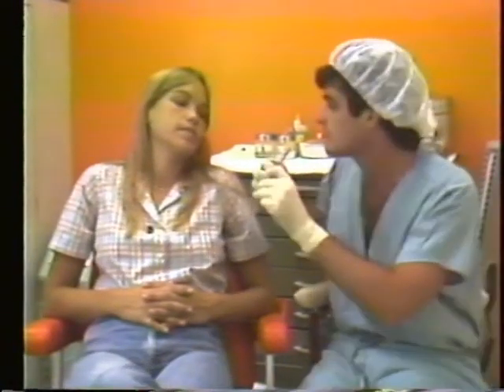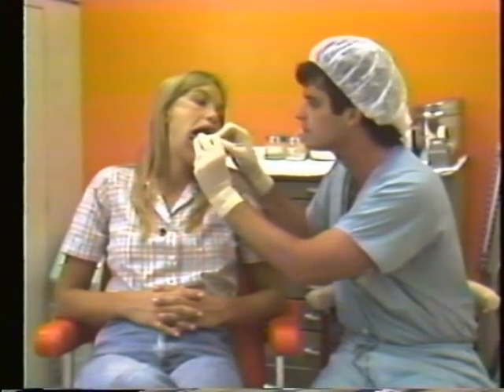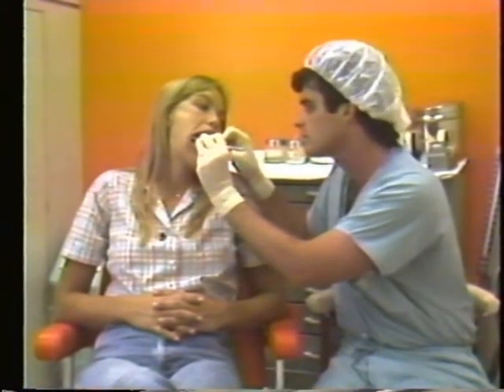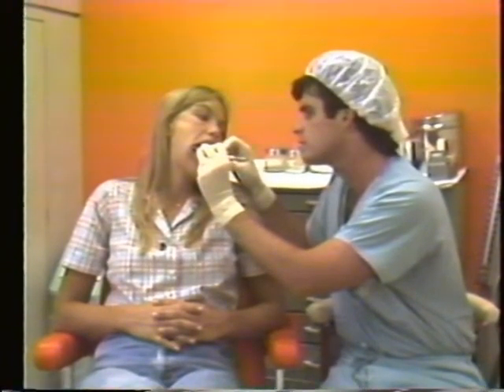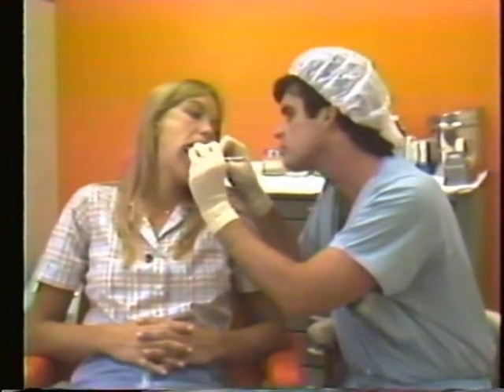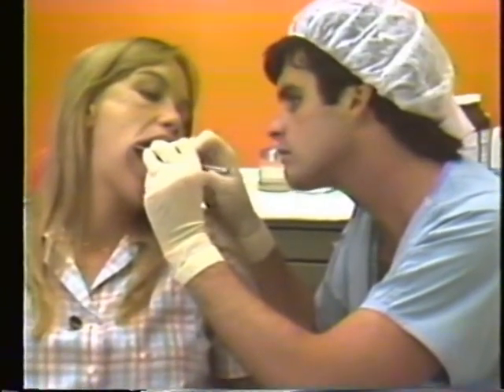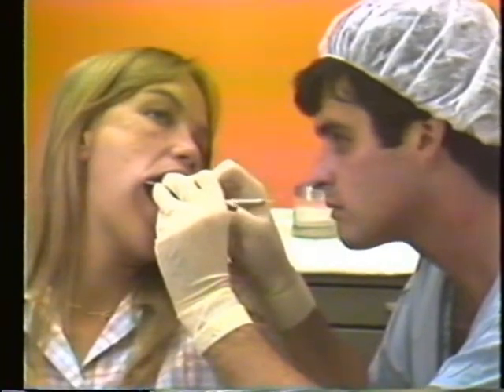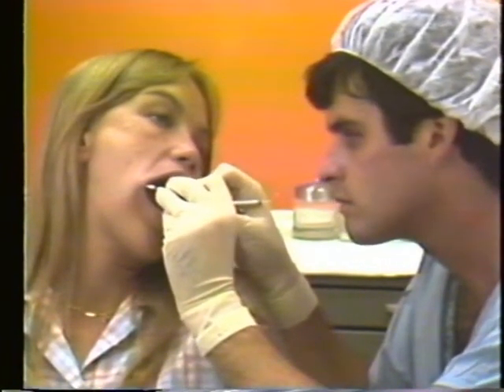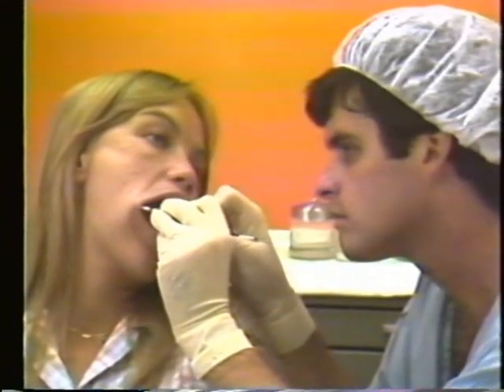All right. There are some common errors in technique which break the chain of asepsis and endanger the patient. After you've gloved, avoid touching an undraped light source. The assistant will drape the light handle. Avoid lowering your hands below your waist. Avoid touching your hair or face. Don't touch charts, x-rays, pens or pencils. Don't touch instruments or equipment that are not on your surgical tray. If you need something, ask your dental assistant to get it for you.